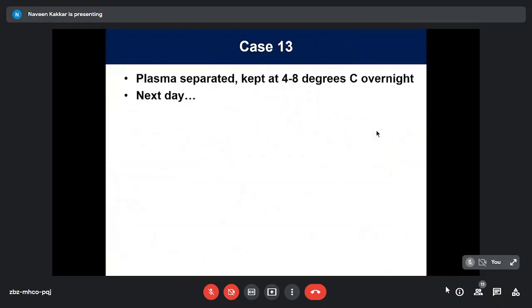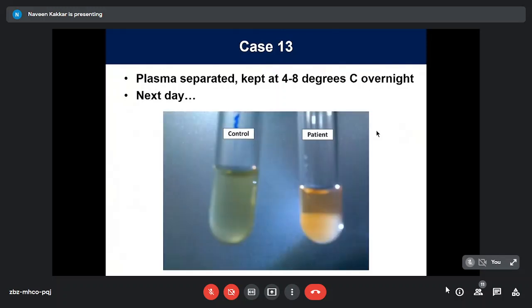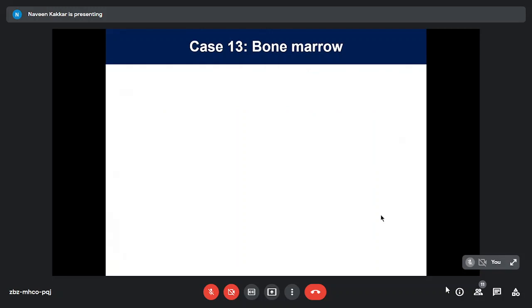So we thought of something, separated the plasma, kept it at 4 to 8 degrees overnight in the fridge. Next day, this is what we got. That was a control plasma, and the patient plasma had a white precipitate coming up. This was cryoglobulins. He had smoldering myeloma; hepatitis C is also a setting for cryoglobulins.